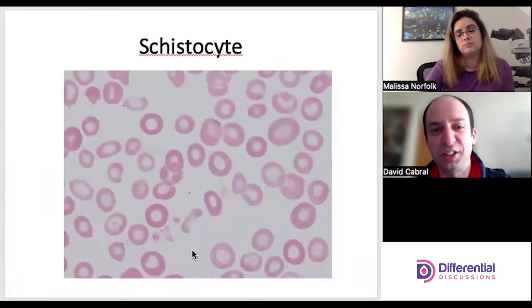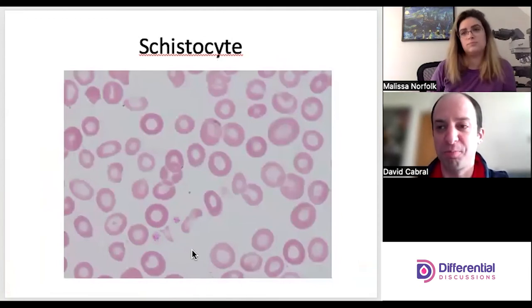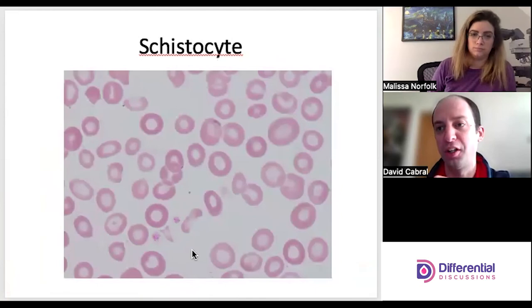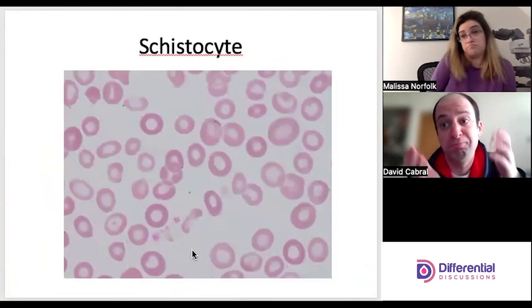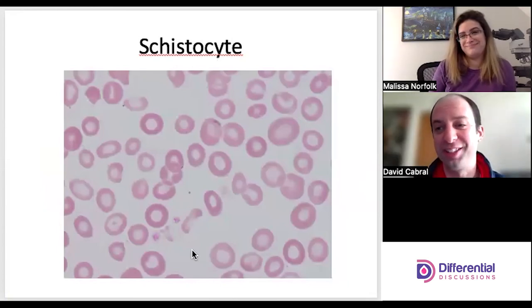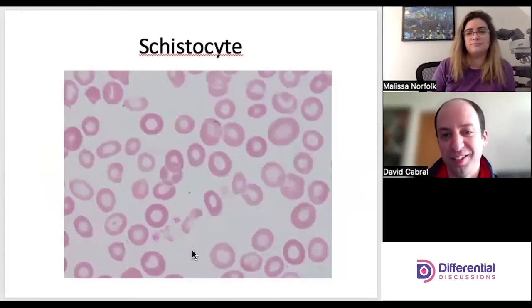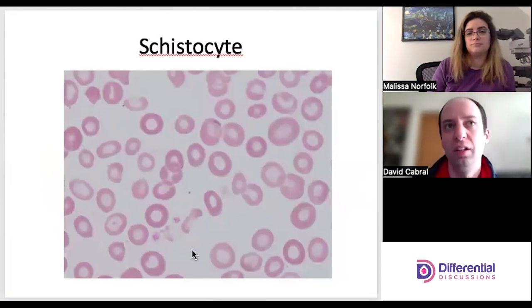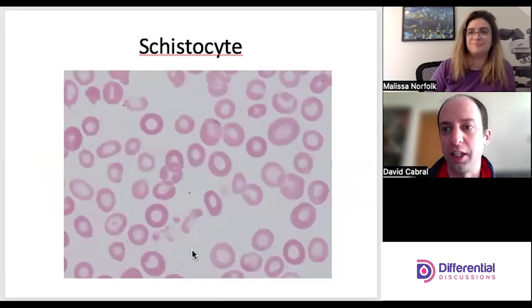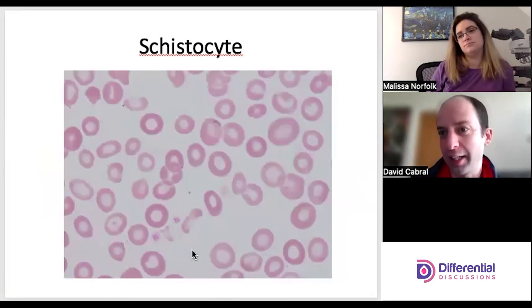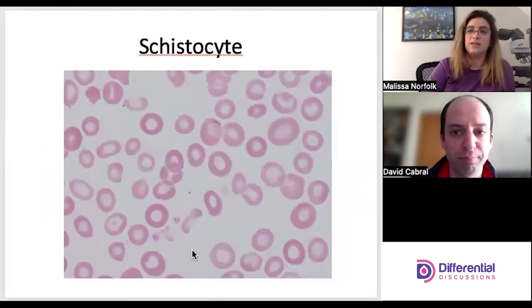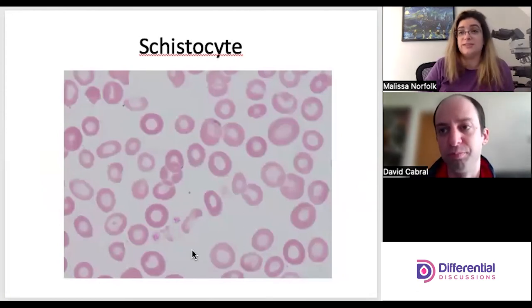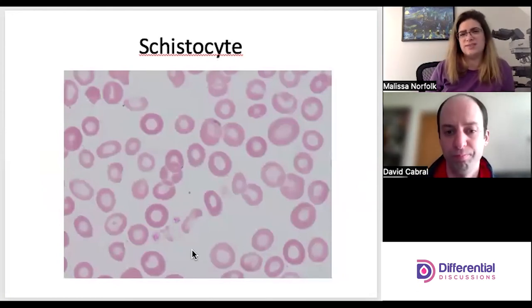Schistocytes usually represent an intravascular hemolytic process where a whole red cell is sheared and ripped to pieces, leaving a fragment. Their shape can be anything — which makes it difficult to distinguish from an acanthocyte. Size ends up being the main differentiator: an acanthocyte is a whole cell, while a schistocyte is a fragment of a cell.